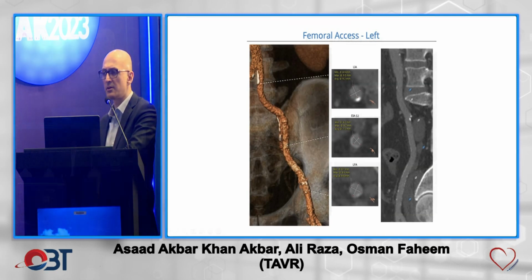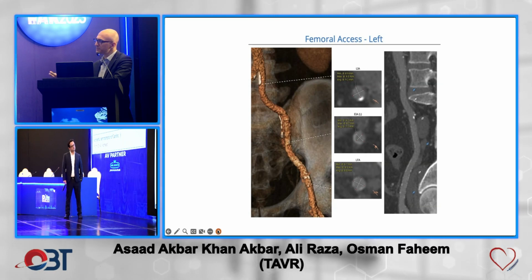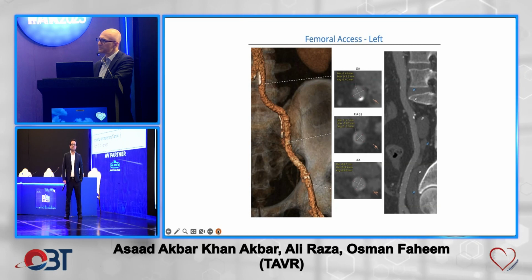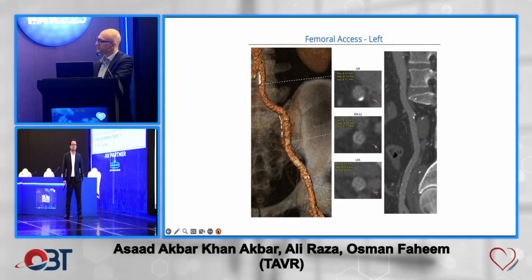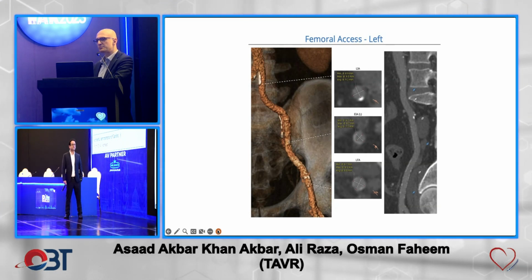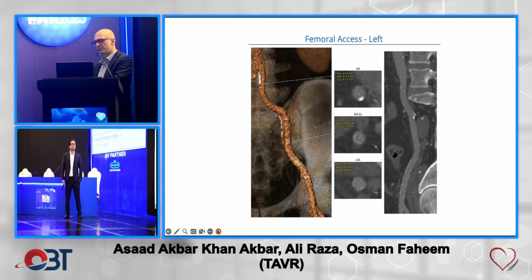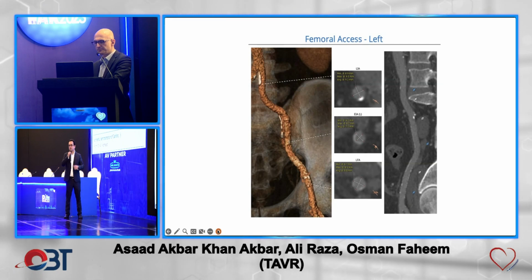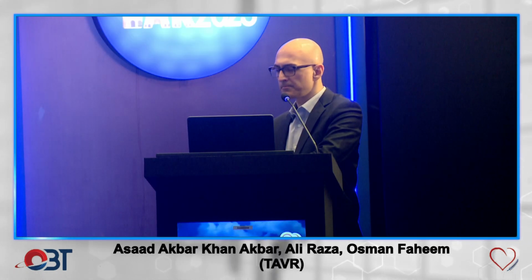And you could have a small vessel with not a lot of calcium. So even with 4-millimeter vessels with no calcium, I'm fairly comfortable going transfemoral because the vessel will expand and accommodate your 14 French equipment. Asad, any thoughts about access? I think that was the exact point we made in our training village session yesterday as well.